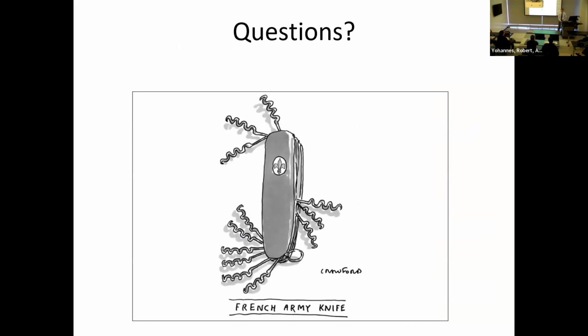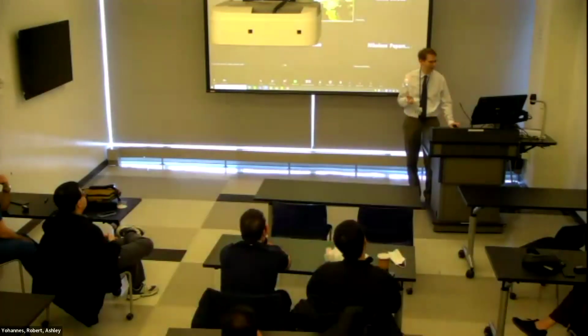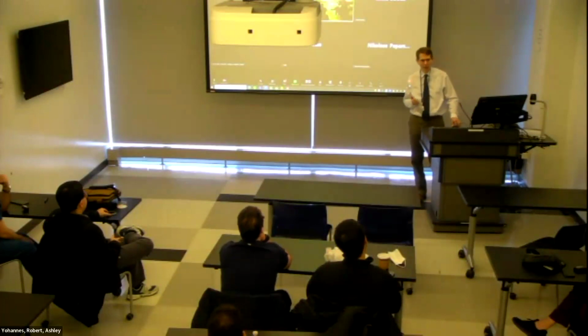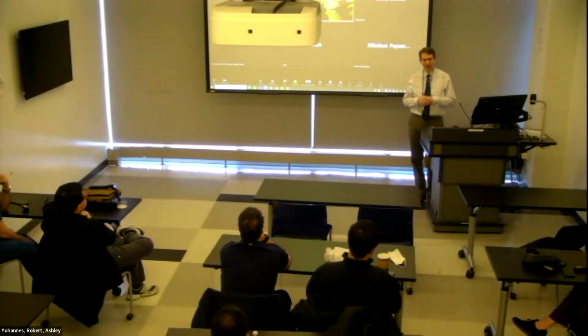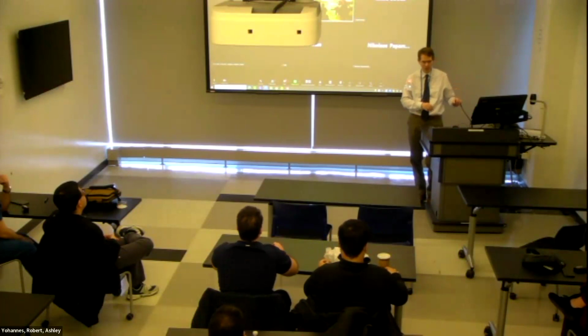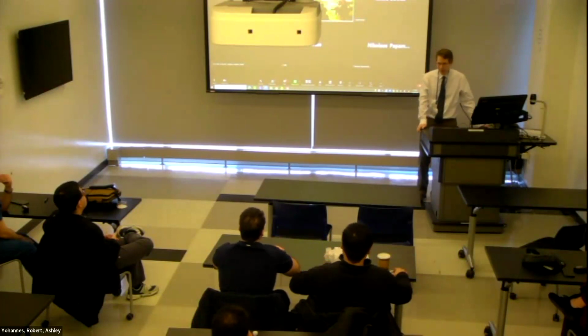So just remember there are 3 steps. We first listen to spontaneous activity. The second is we analyze the units. And the third is we look at recruitment. And we talked today about the most common thing that we look for in terms of differentiation, which are neurogenic processes and myopathic processes, and each one with their characteristics. Any questions?